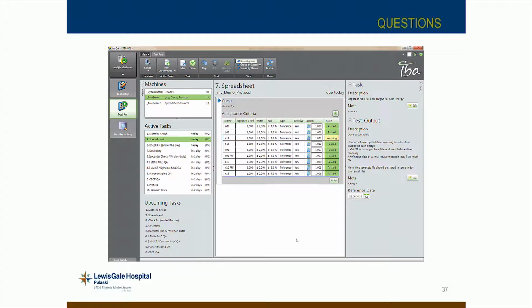I did not have that cockpit-level access to my QA, at least for patients, on knowing who's been acquired, who's been analyzed, whether fluence maps have been made for somebody, and then of course all of the trending for things that I typically had on paper.